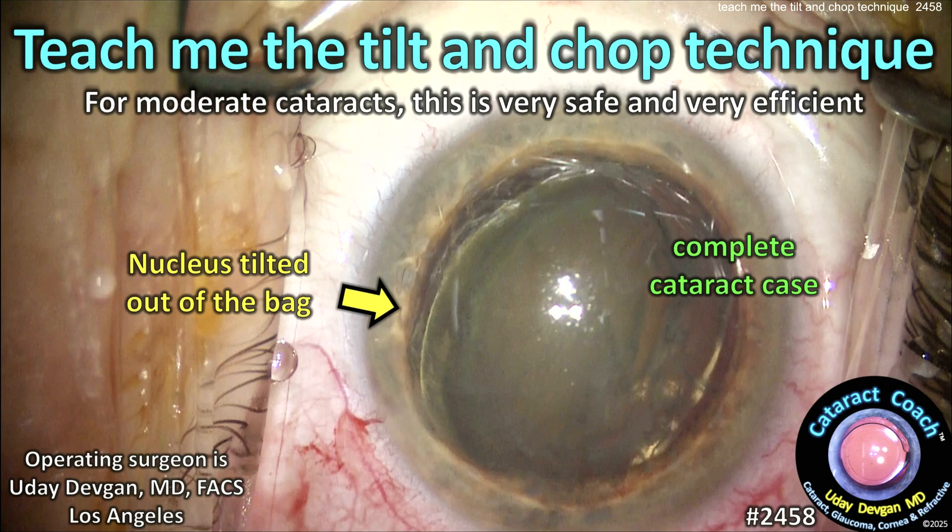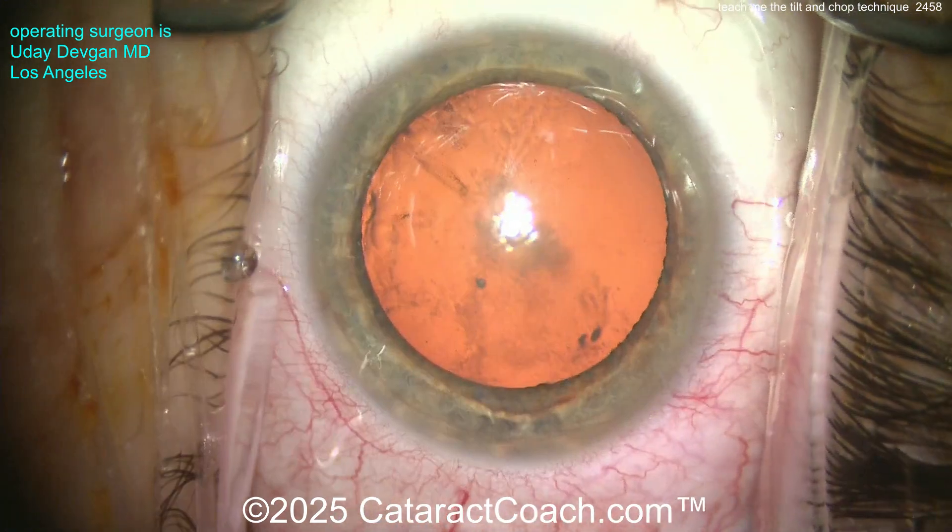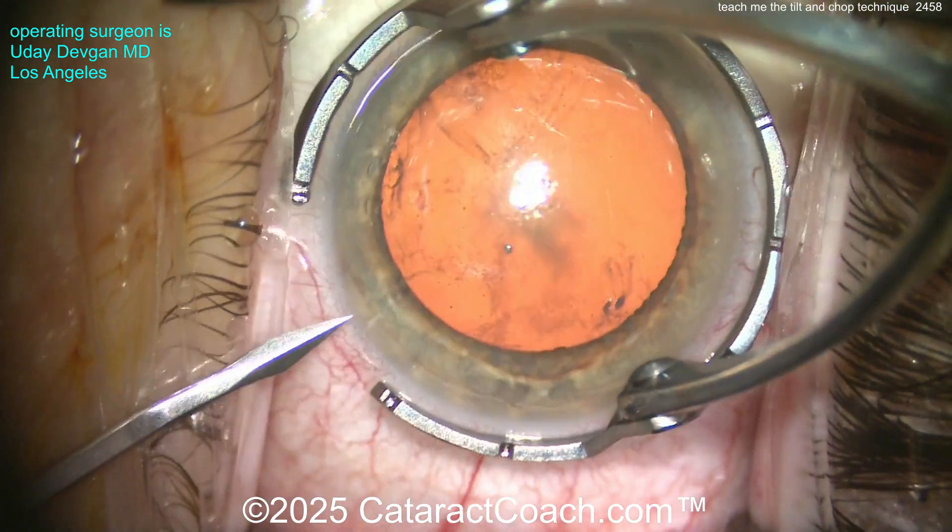Cataractcoach.com — teaching the tilt and chop technique for modern cataracts. This is a very safe and very efficient procedure. You'll really love it. It's a complete cataract case; I'm going to share the whole case start to finish.